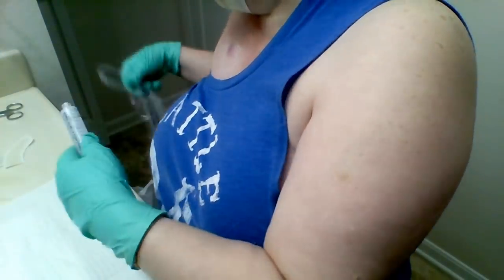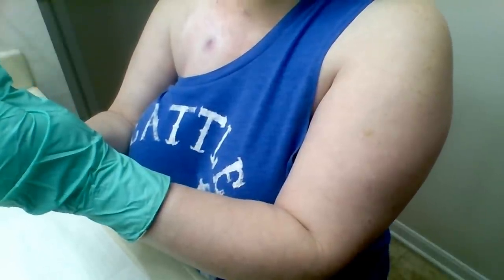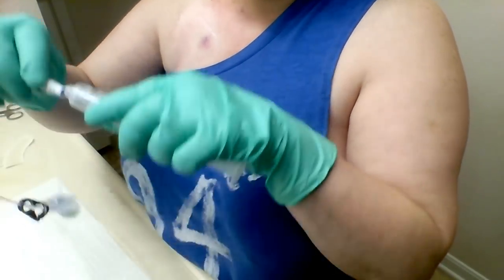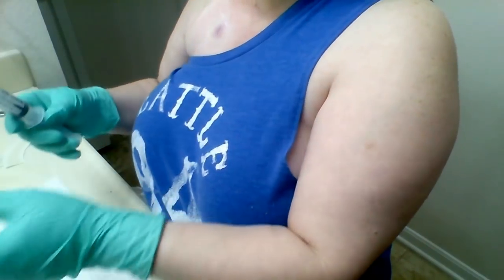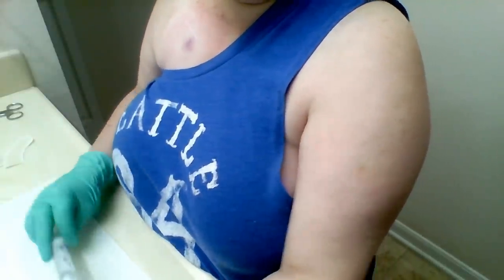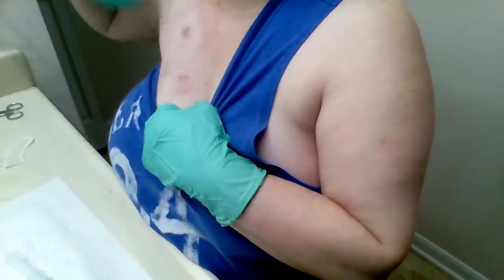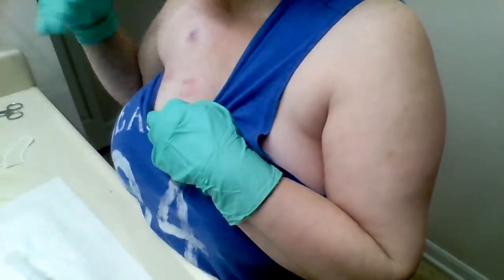You're going to pull back and get it through. Now we're going to take it, just like that — twist it. This is when you are flushing through, because you don't want any air coming through your port, so just a little bit — don't take a lot. You go ahead and take a little thing off of it, and it should be getting nice and dry by now. I can't blow on it, so I just have to wait for it to dry.